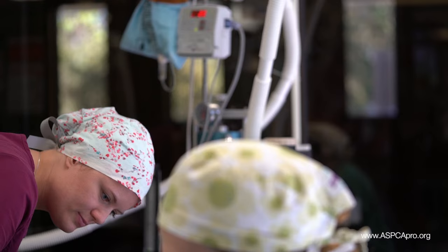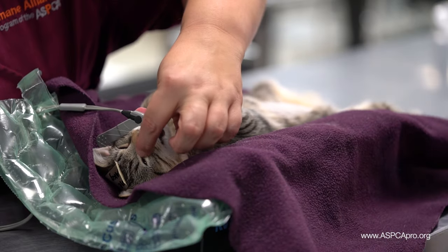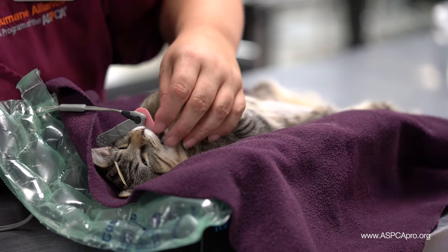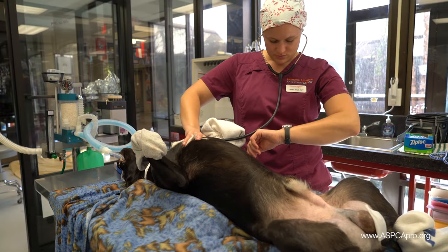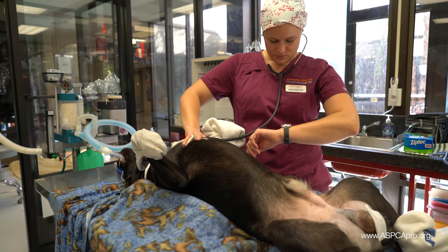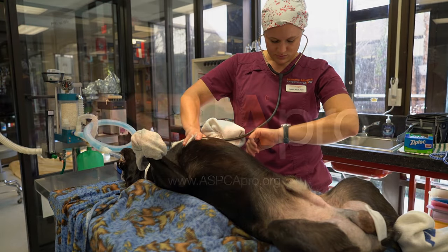Conduct this monitoring on all patients under anesthesia frequently. It will become a scan that can be performed quickly, and abnormal parameters will begin to stand out.